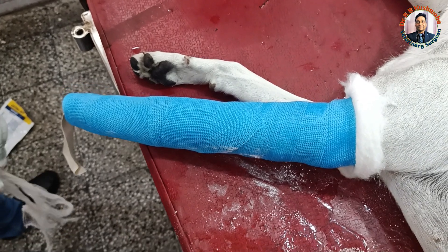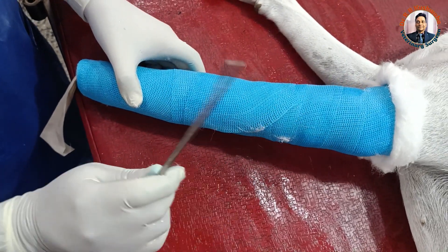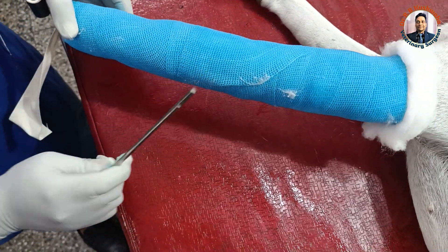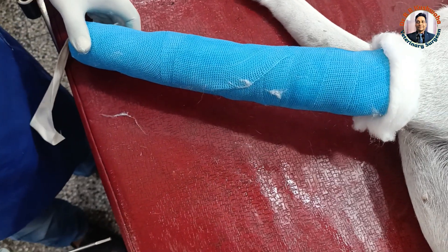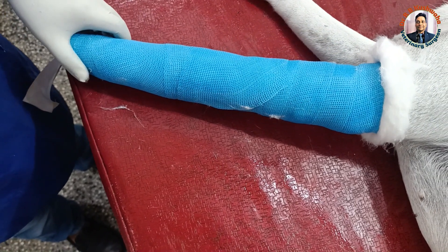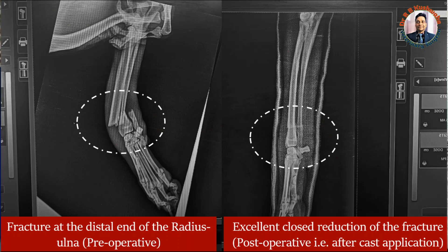Then we go for the post-operative X-ray. This fiber cast — you can see it is completely dry. If I strike with it now, see the strength — this is the advantage of this fiber cast application. The only difference is that it is more costly compared to the plaster of Paris cast. Now we go for the radiograph to see how much difference there is between the pre-operative and post-operative radiograph — whether the reduction is 100 percent or slightly reduced.